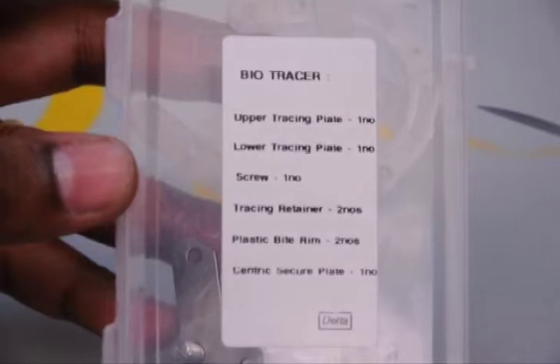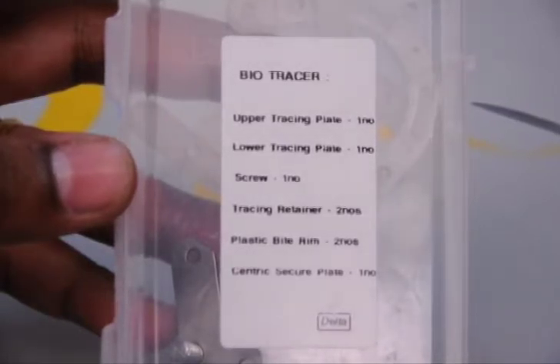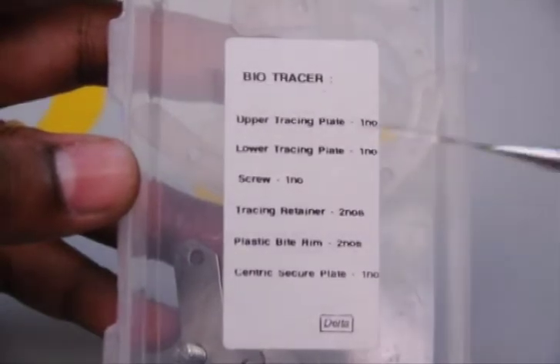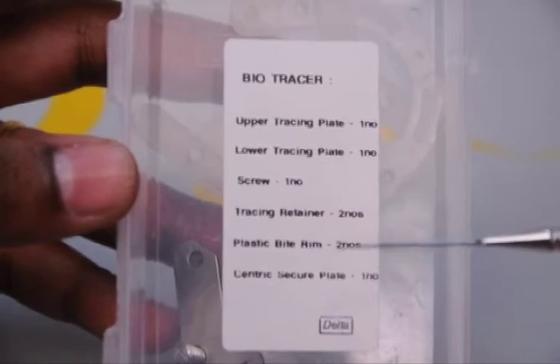Good morning everybody. Today we are going to see about a new set of intraoral tracers which has been introduced. These are called as the bio traces, and the bio traces has 6 components in it.